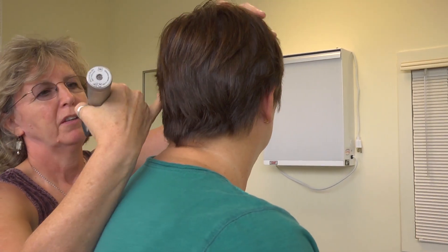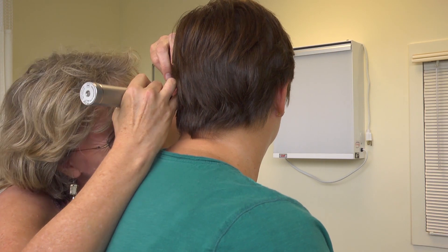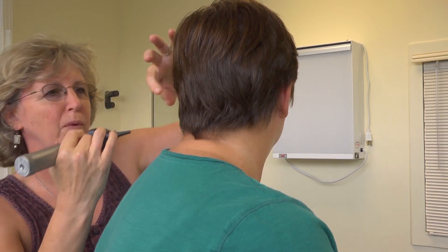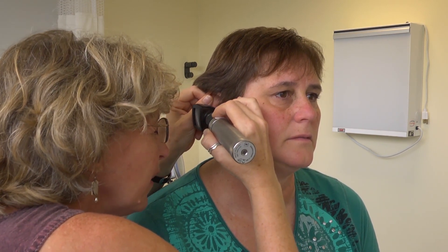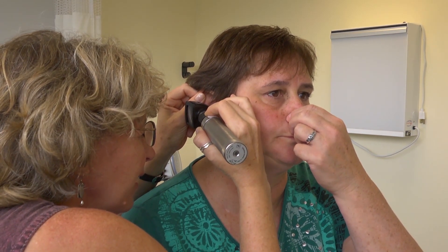For the other side, I don't change hands but prop my finger against the back of the head, place it in, and go look. If I see a lot of hair, I go a little bit farther. If I can't find the tympanic membrane, I adjust by moving the otoscope rather than shoving it in farther. To check for mobility of the tympanic membrane, you can use an insufflator, or get a good seal and ask the patient to hold their nose and blow very gently — that change in pressure moves the tympanic membrane and you can assess mobility that way.